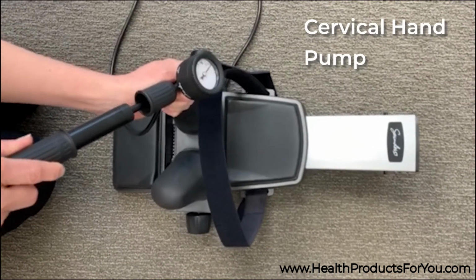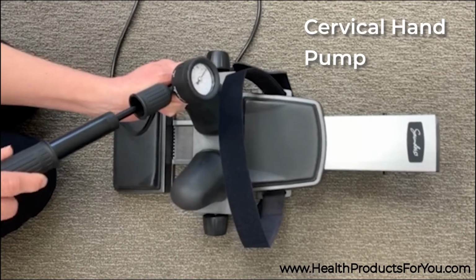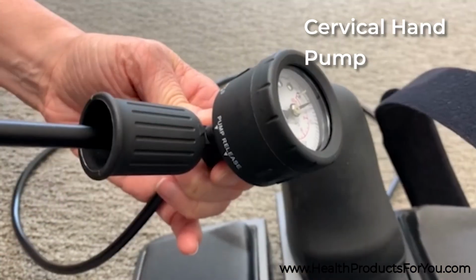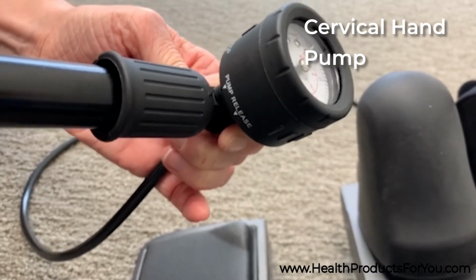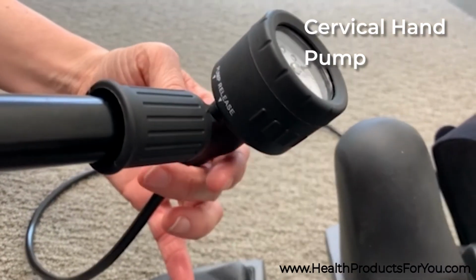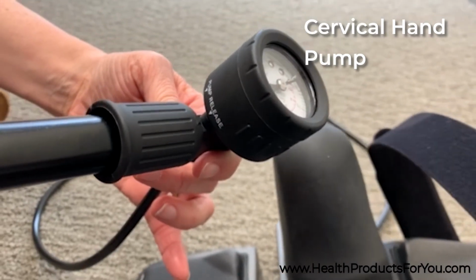A cervical hand pump. Make sure that the air hose is not being pinched by the bottom of the unit. Make sure you have enough room to lie down in a comfortable position. Now you are ready to apply traction using the pump.